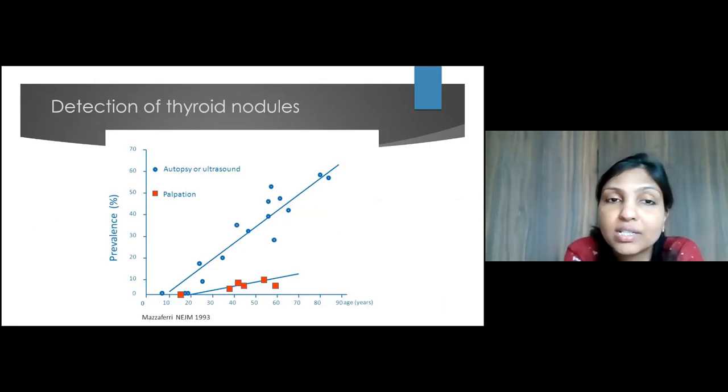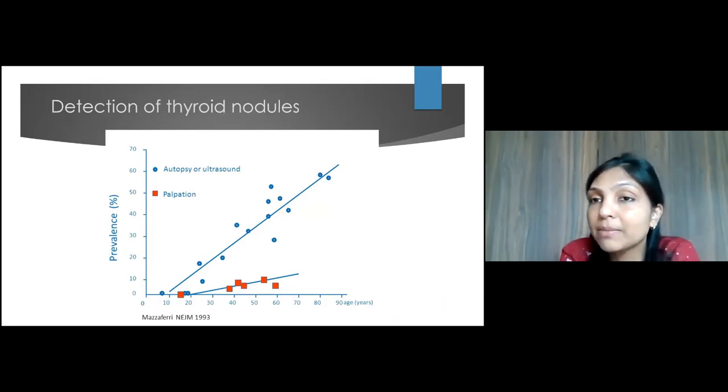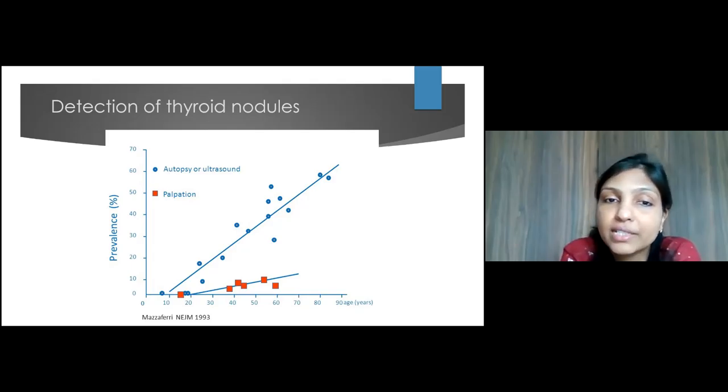So, just keeping in line with what Dr. Rakesh also mentioned, a large part of the nodules are missed. If you only look at the data that we have available for ultrasound imaging versus palpation, a significant proportion of these nodules may be missed.